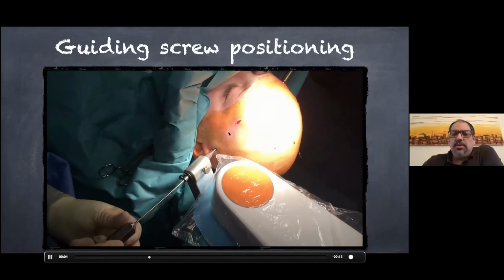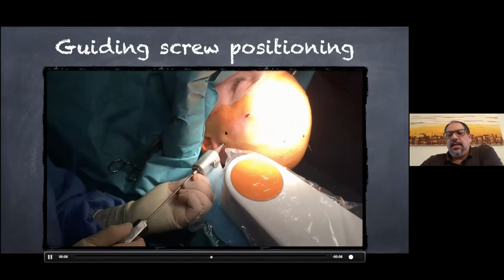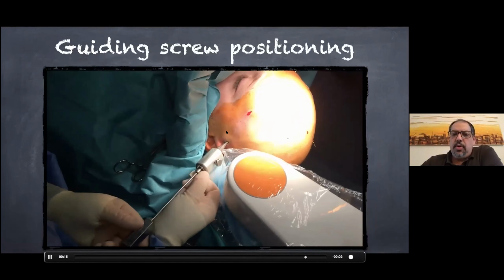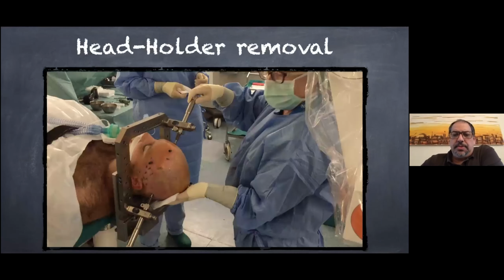It's a hollow guiding screw that is tightened into the skull. And it's called guiding screw because it is not only an anchor bolt, but it's also the tool that guides the trajectory of implantation of the recording probes.